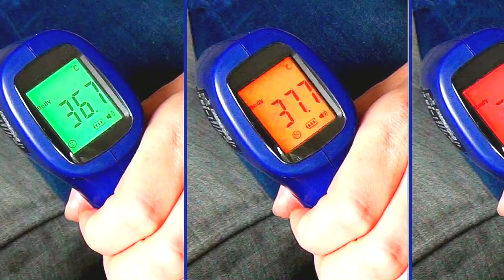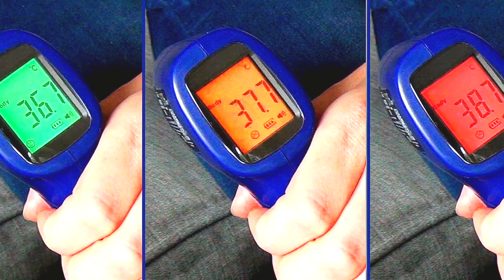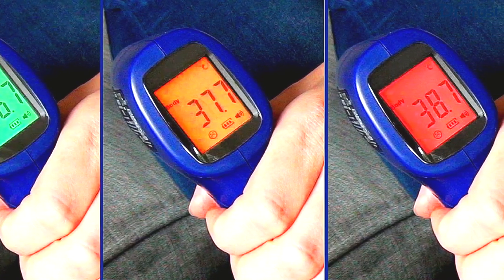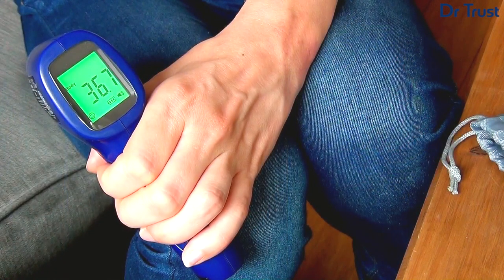The unique traffic light LED technology and accompanying smiley face helps you determine quickly and easily whether your temperature is normal, warm or high, and the value in Celsius or Fahrenheit will be shown on the screen.